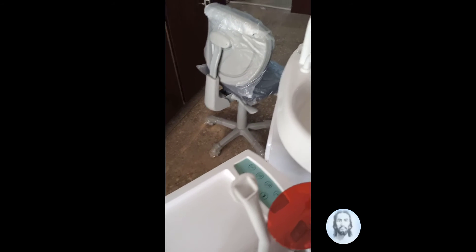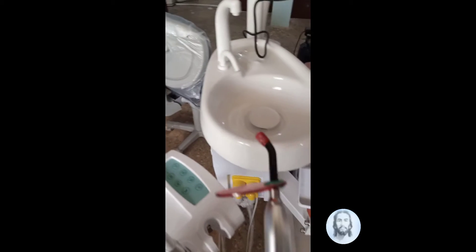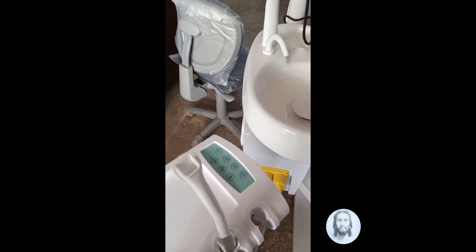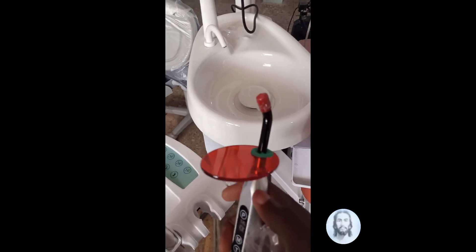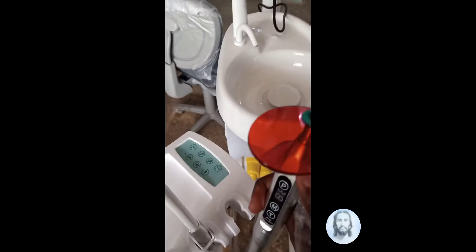Over here is the curing light. This shield helps to prevent the ultraviolet light from reaching the eyes of the dentist.